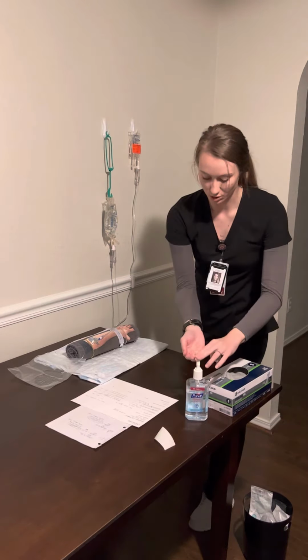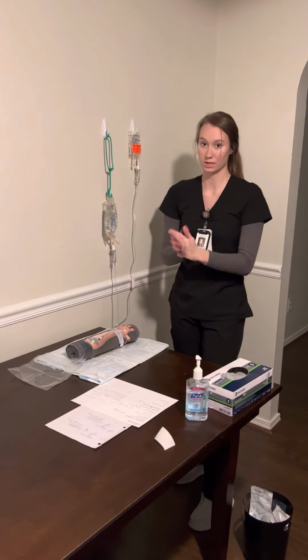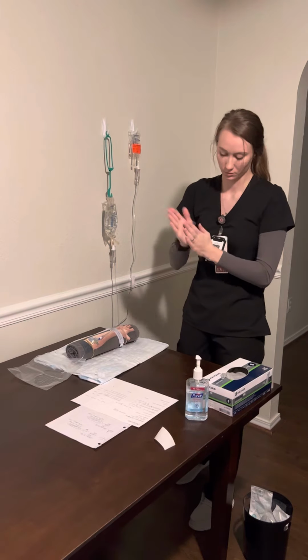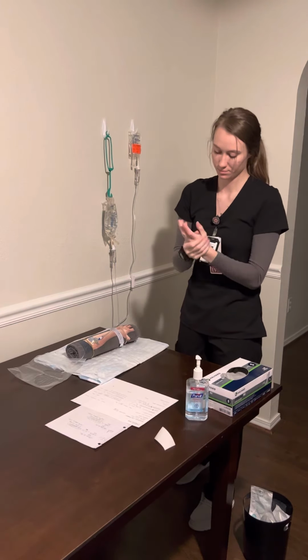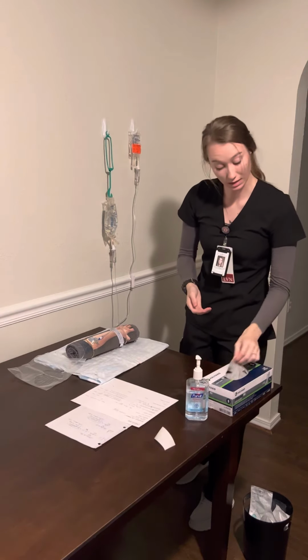I'm going to wash my hands again so that we can assess her site now that both of them are running. Make sure my hands are dry. Put on a pair of clean gloves, excuse me.